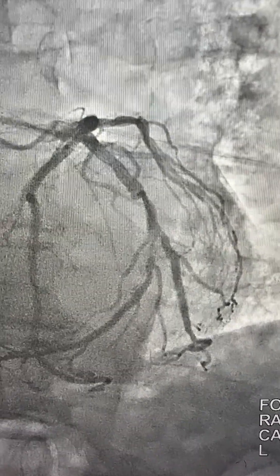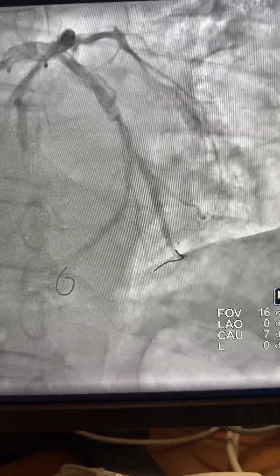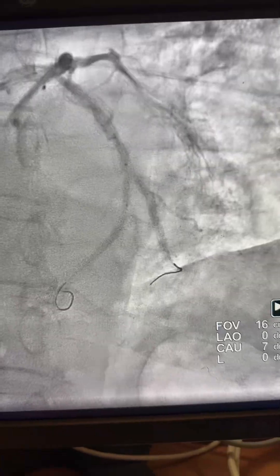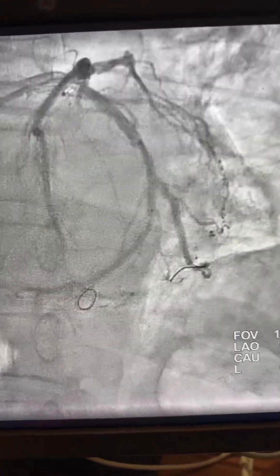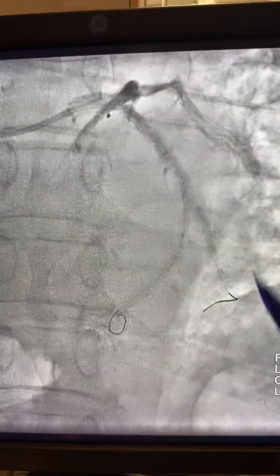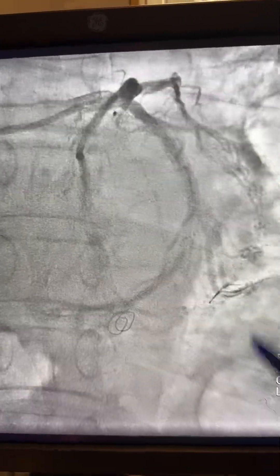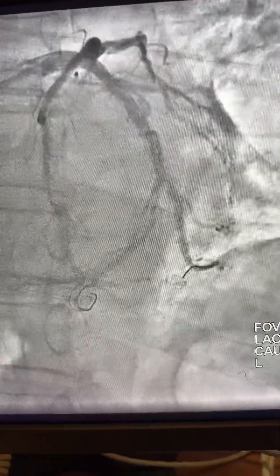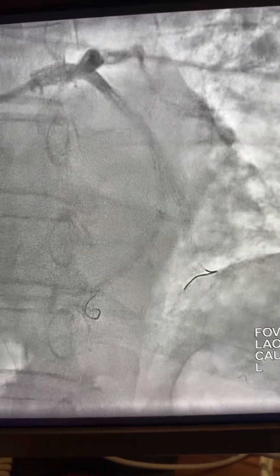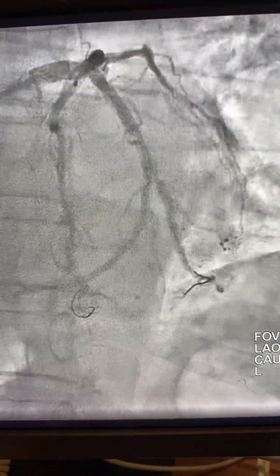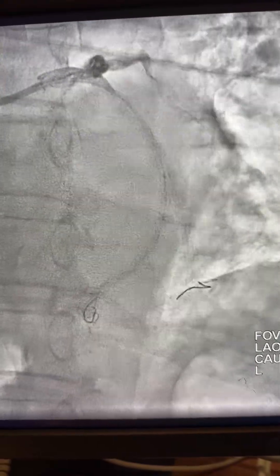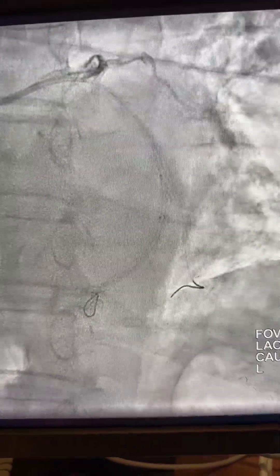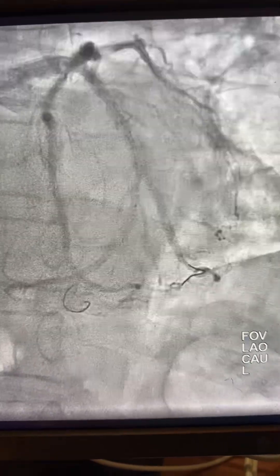Here is the distal circumflex toward the PDA. We started the intervention with an XB3.5 from the radial approach. There are two wires — one toward the OM and one toward the PDA. They started to balloon and then used the shockwave 2.5 toward the circumflex and PDA.